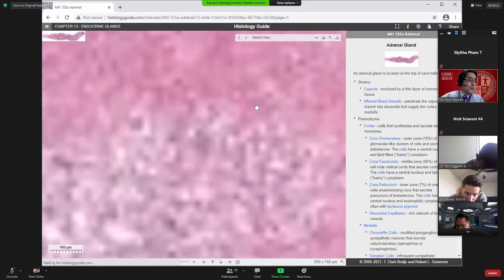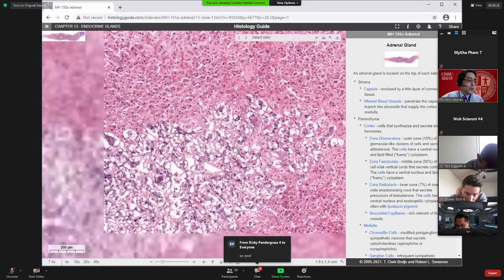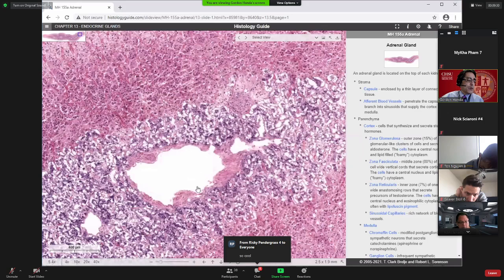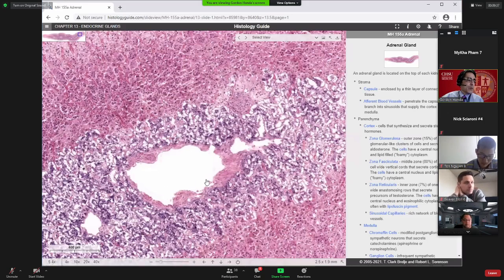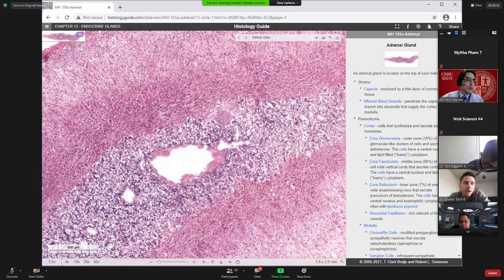Okay. Now, one other feature I want to just mention in passing is, if you stroll through the medulla, you find these fairly large veins. I think they call them adrenal medullary central veins. And that's where the blood that goes all the way through the cortex, remember, the blood's coming in this direction, this is where it ends up eventually, in this large vein. And also the products from the medulla drain into these veins.